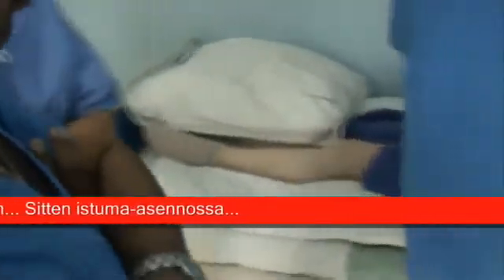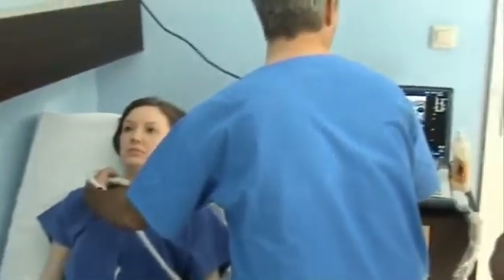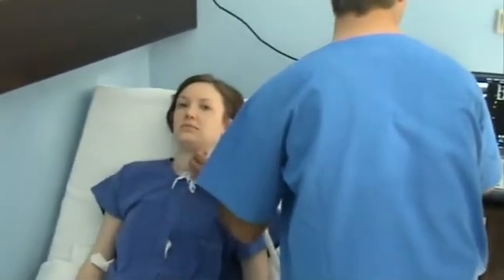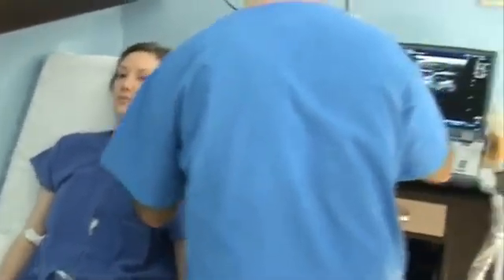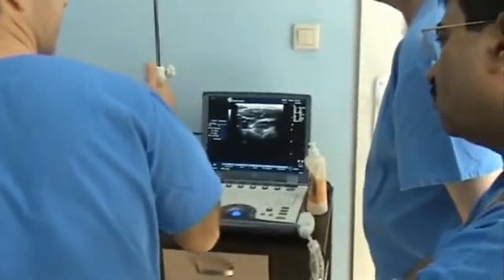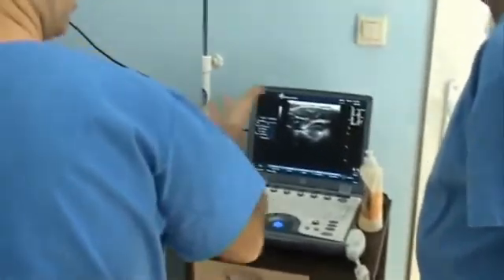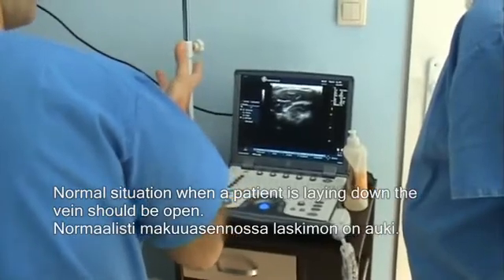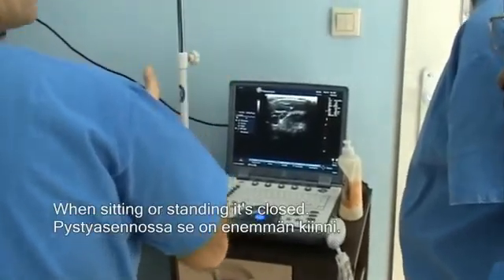So sometimes in such cases, the valve opens for five seconds, but not here. This is what you would expect, right? The sitting should be lower pressure. But sometimes, again, pathology. In a normal situation, the patient is lying down, so the valve is open. When you sit and stand, it's closed.